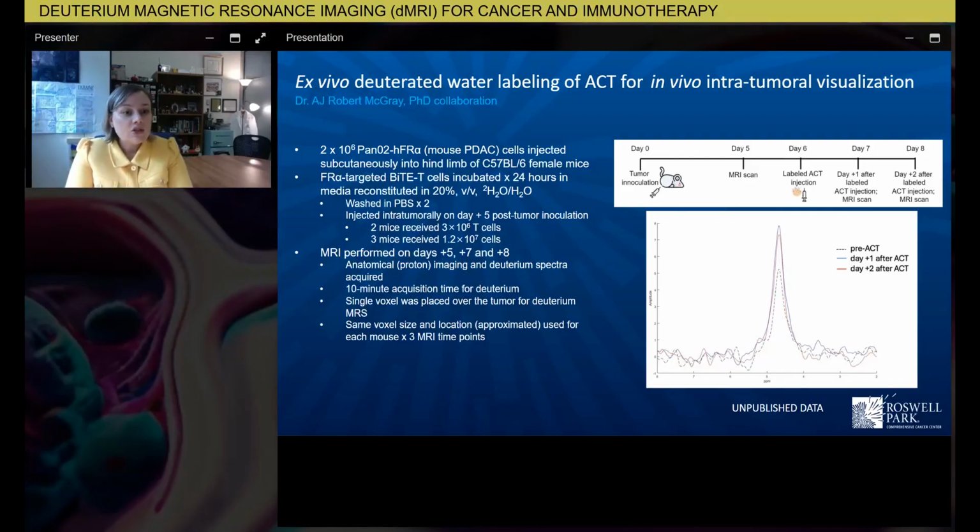So I initially was labeling cells in vivo and looking at their DNA. I knew that my T cells and graft versus host cells labeled up from systemic administration of deuterated water. But what if I did it in cell culture? For example, if we make media in deuterated water, we can potentially track these cells in vivo after they're administered systemically. So the patient isn't drinking the deuterated water, but it's your cells as they're being expanded.